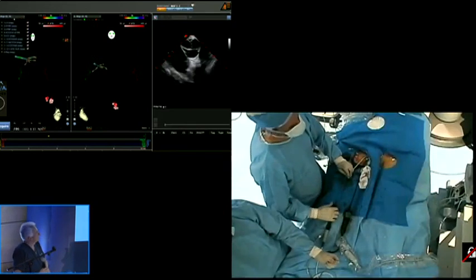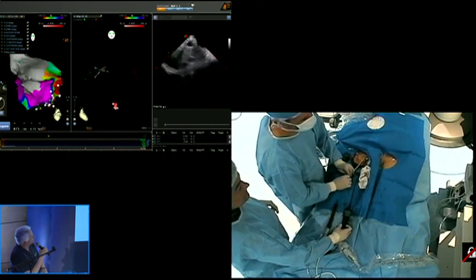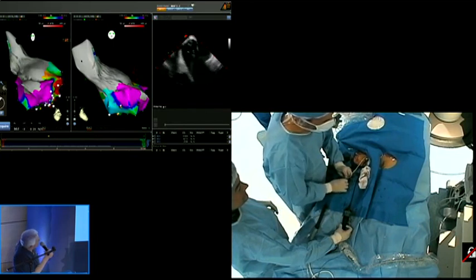What happened to the map? I need to see the map. If I don't have the map, I can't go through. Show me the map. There you go. I need to make sure that I'm through. I don't think I'm through yet. Yeah, you're still above the valve. I can see me in the ICE.